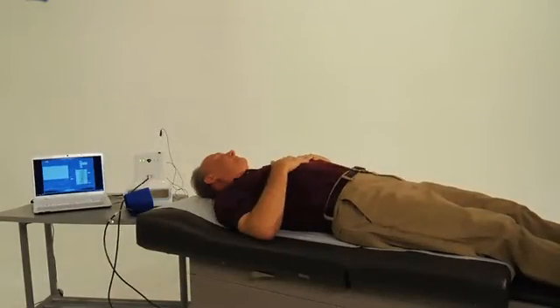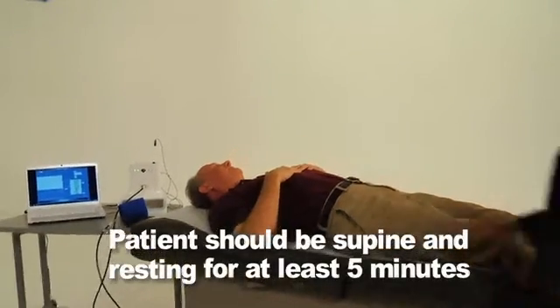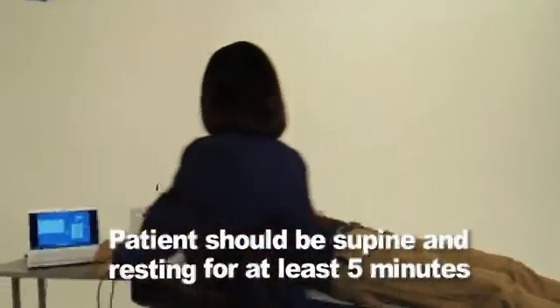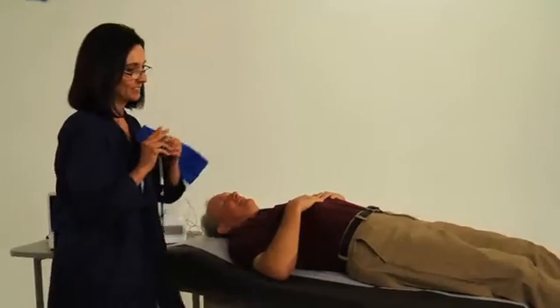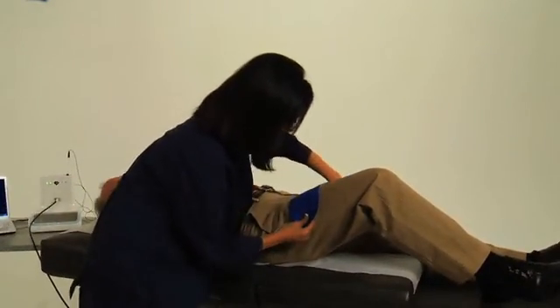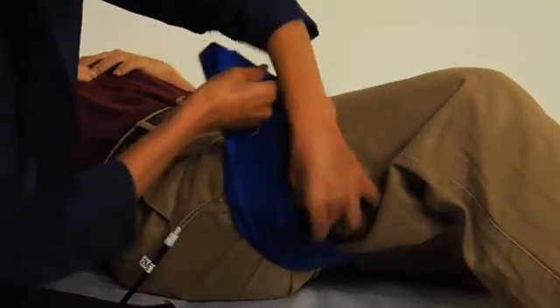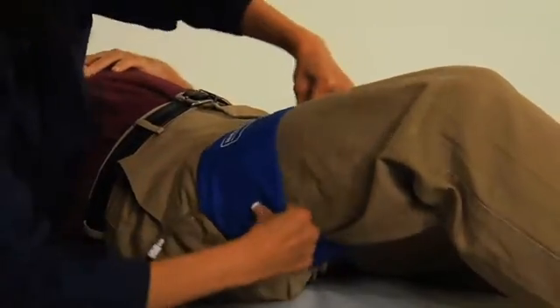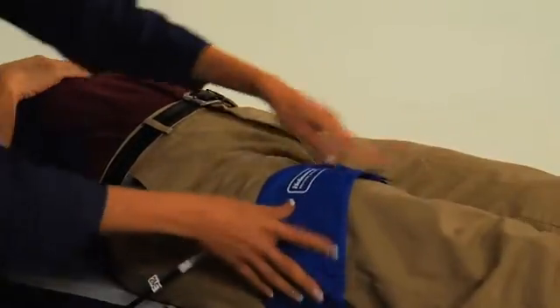During a pulse wave velocity measurement, the patient should be supine and have been resting for at least five minutes before the measurement is taken. Place the thin blue femoral cuff as high as possible around the patient's thigh, over thin clothing only, and make sure the cuff is straight. The tubing on the cuff should be on the top of the patient's leg and pointing towards the patient's head.